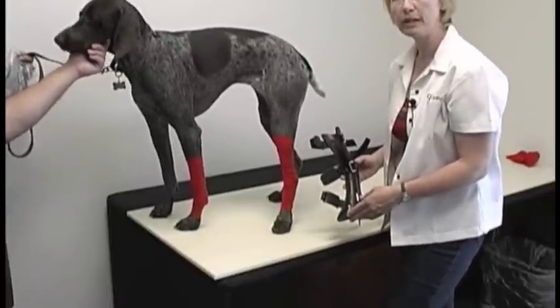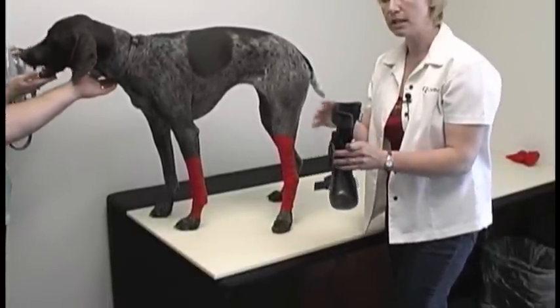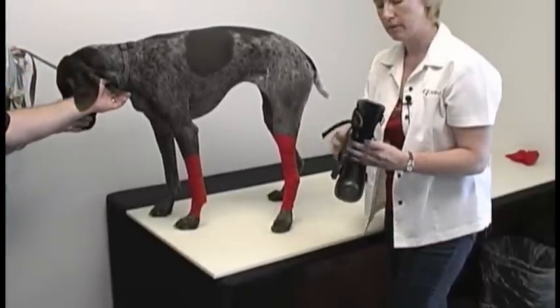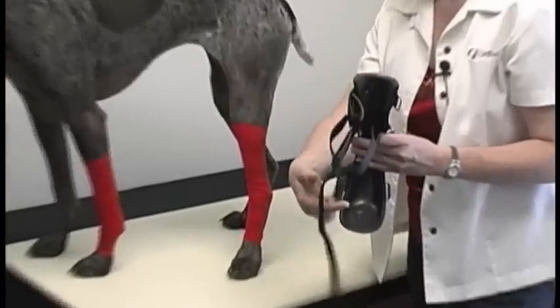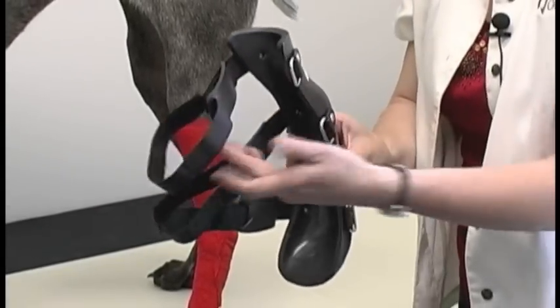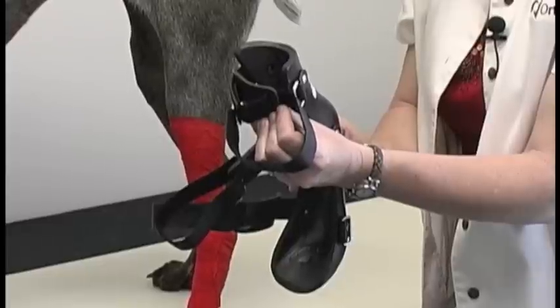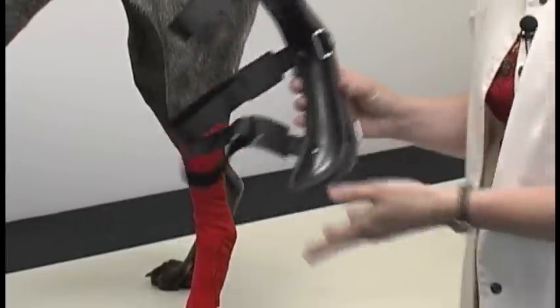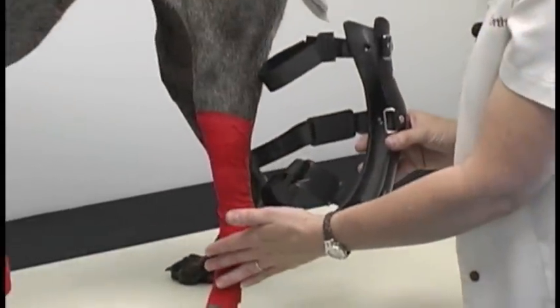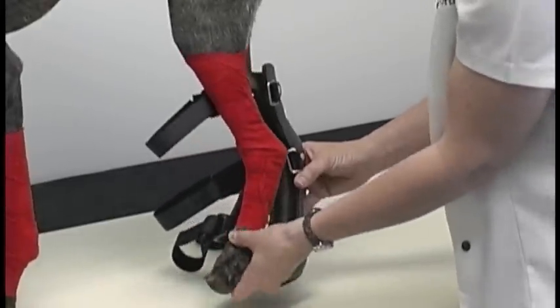We're going to fit a rear limb splint today. Again, we're going to begin with loosening our straps and getting them in position, making sure our strap pads are in the middle of the strap so they come around and are positioned in the middle of the limb when the straps are tightened. For a rear limb splint, it's usually easiest and most user-friendly if the dog is standing, so we're going to slip this on.